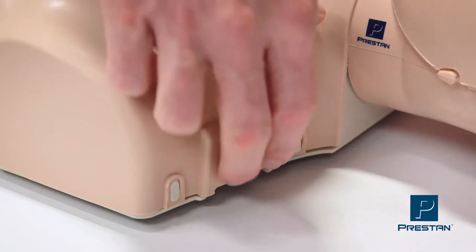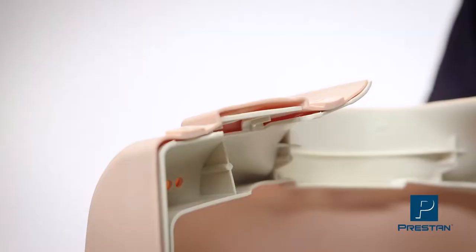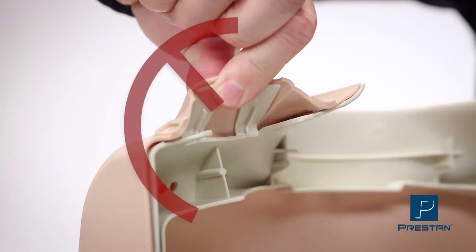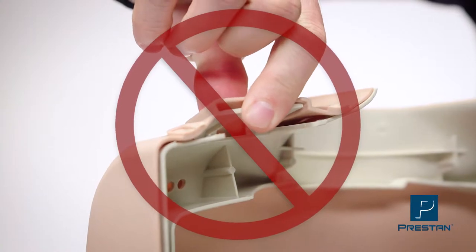First, open the torso by gently releasing the tabs at the shoulders. Remember not to pull hard or overextend the tabs, as this may stretch the plastic over time, compromising the tabs' ability to lock.